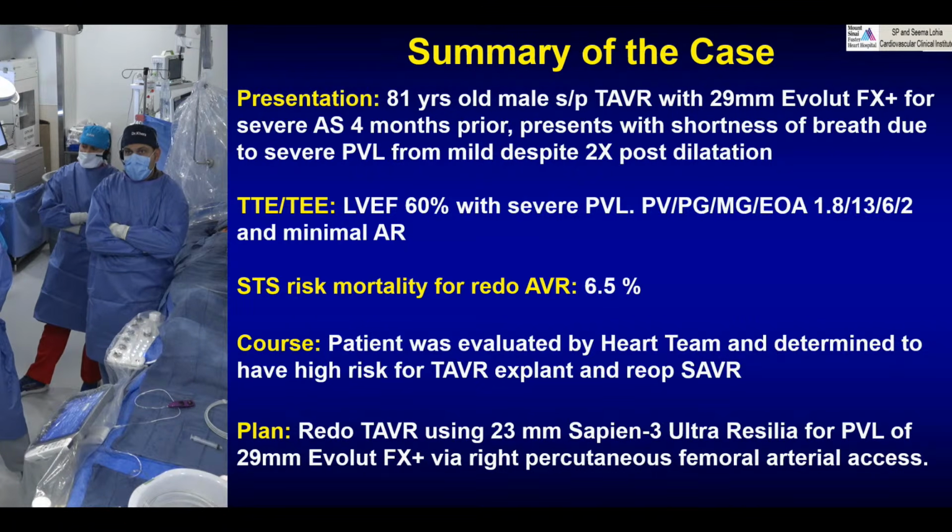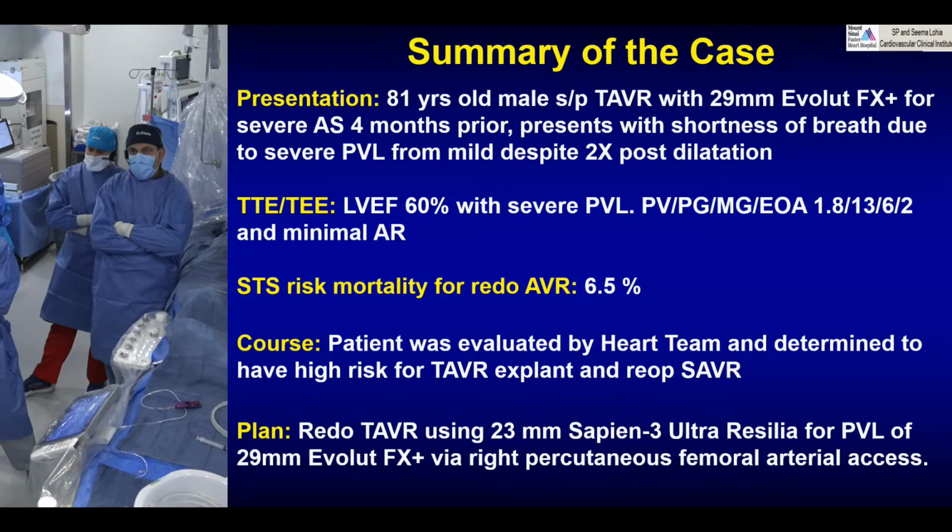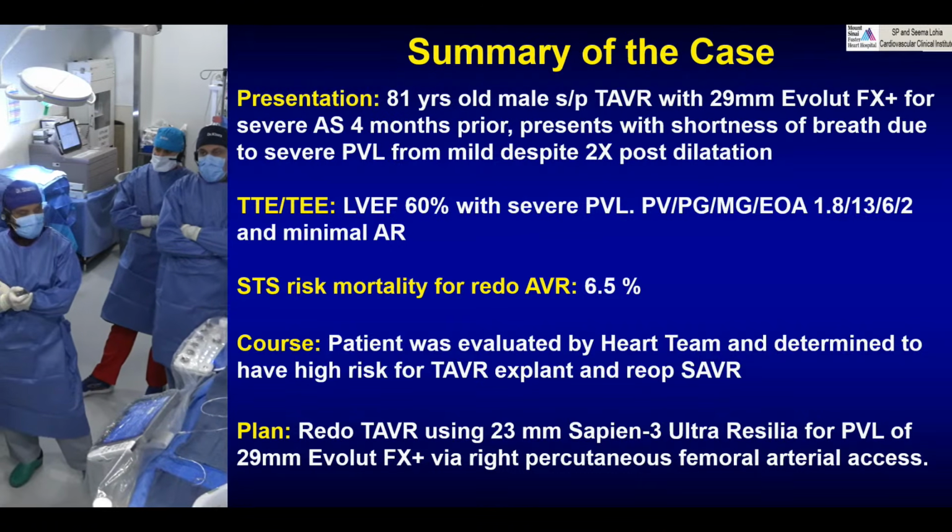We don't see that much. All the redo TAVR people talk about in conferences are structural valve deterioration, longer-term degeneration. This is more acute, within 1 year, within 6 months, and the mechanism is PVL. So that's why I think we are agnostic. I think we should have a discussion.